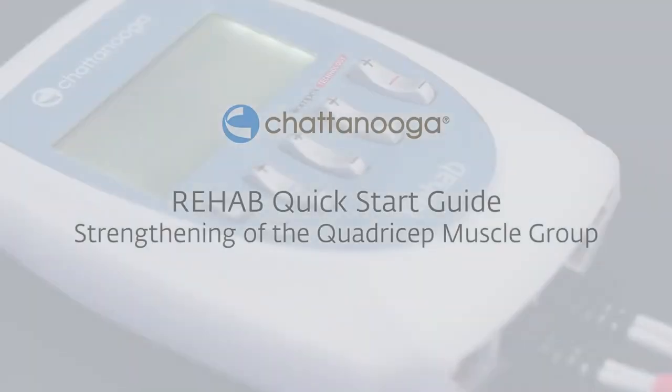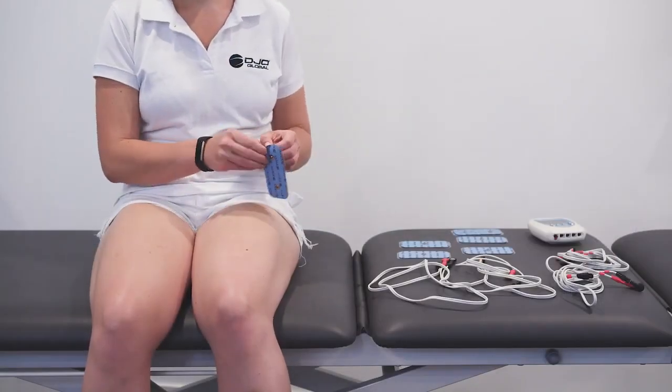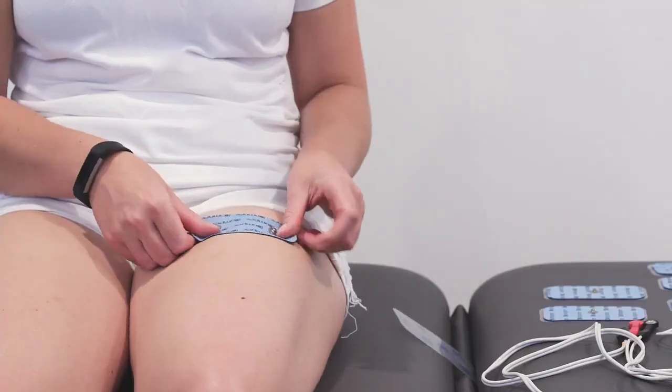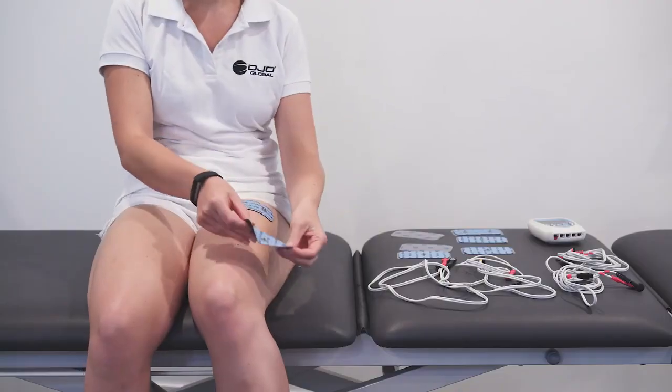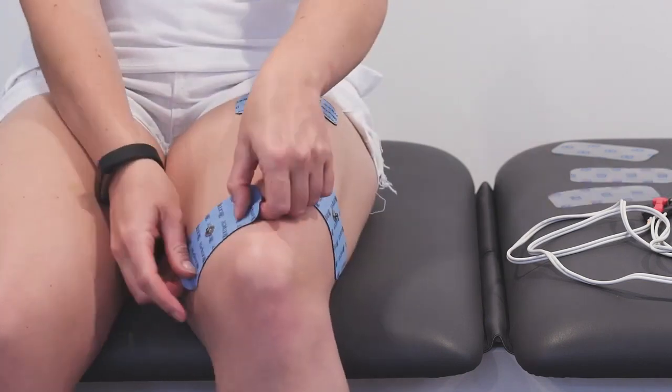Thank you for renting the Chattanooga Rehab handset. Place your electrode pads starting with the two pin pad at the top of the leg, followed by the single pin pads on the lateral and medial side of the affected leg.